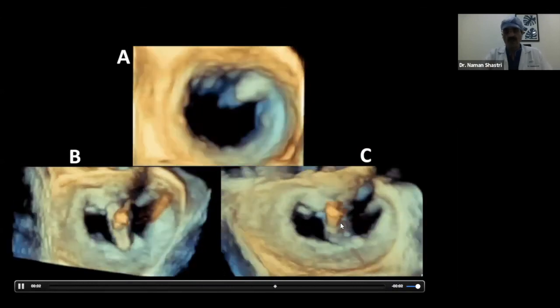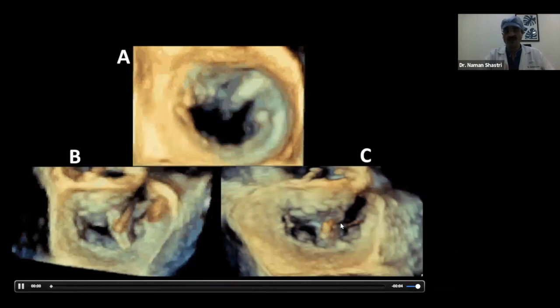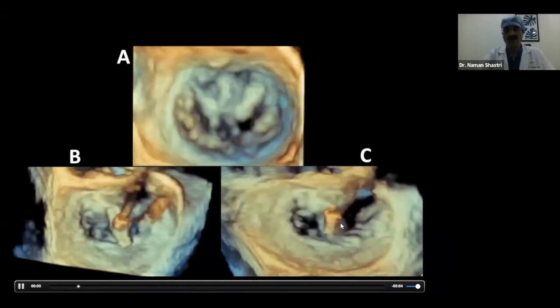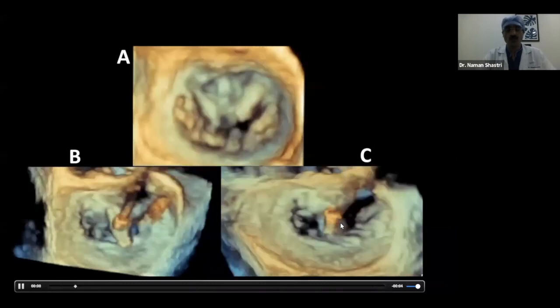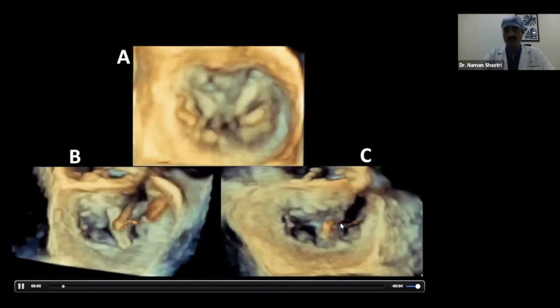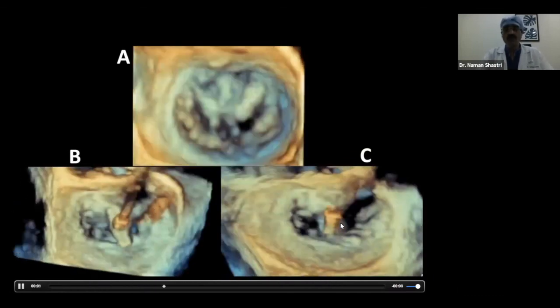So basically, for us, 3D assessment of the mitral valve is useful pre-operatively for assessing repairability, intraoperatively to discuss with the surgeon, and post-repair for assessing regurgitation and stenotic quantification, as well as in the intraoperative cath lab, like in balloon mitral valvotomy for assessing the feasibility of the balloon mitral valvotomy by looking at the commissures, for the repair, the anterior and posterior mitral leaflet assessment, and when you are grasping your leaflet with the MitraClips. So this is how you are going to take great help in the perioperative period.